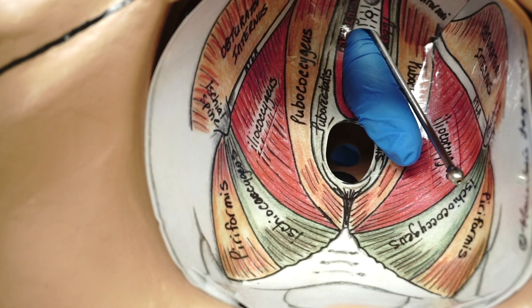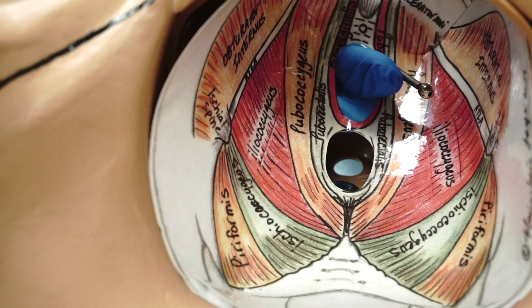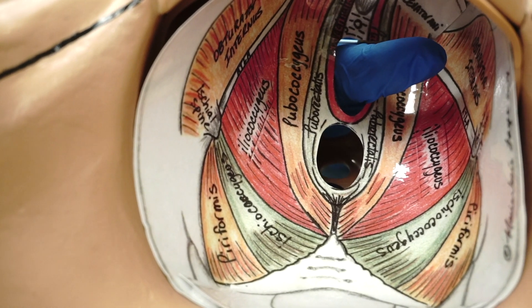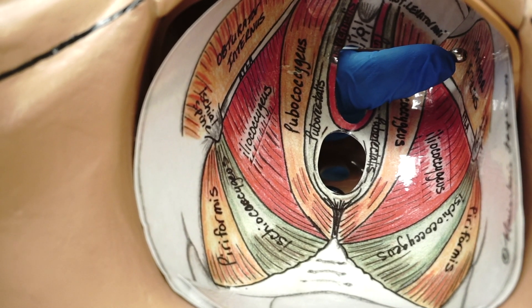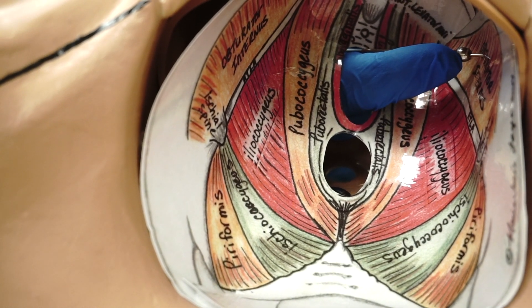The next muscle that we will inject is obturator internus, which is located on the pelvic side wall. The finger is placed at 45 degrees and upwards. The Iowa trumpet is pushed against the obturator internus, and the needle is injected with solution.